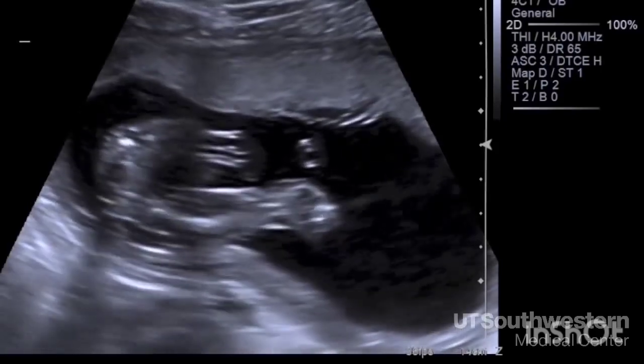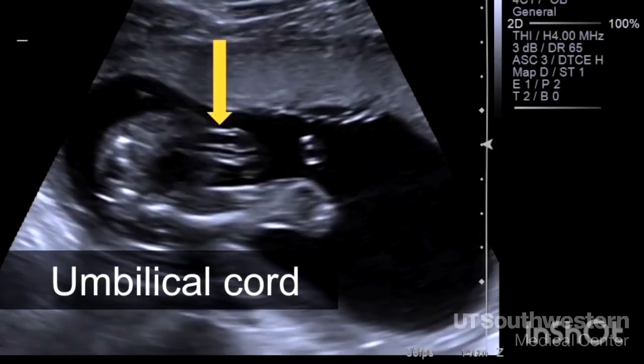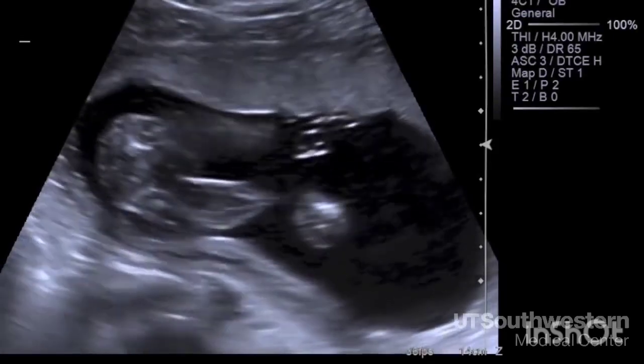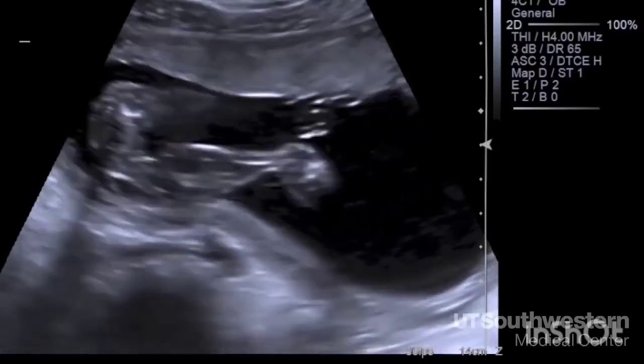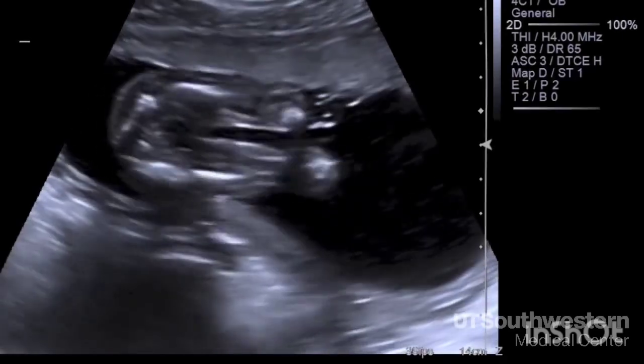Looking further down, we see these little lines. That's where the umbilical cord is actually attaching to the baby's abdomen, so the future site of the belly button. We check to make sure that that part of the abdominal wall has developed normally. And finally, all the way down in the baby's pelvis, we see another black dot, which is the baby's bladder. That tells us that the kidneys, which earlier we saw appear normal, are functioning and producing urine.